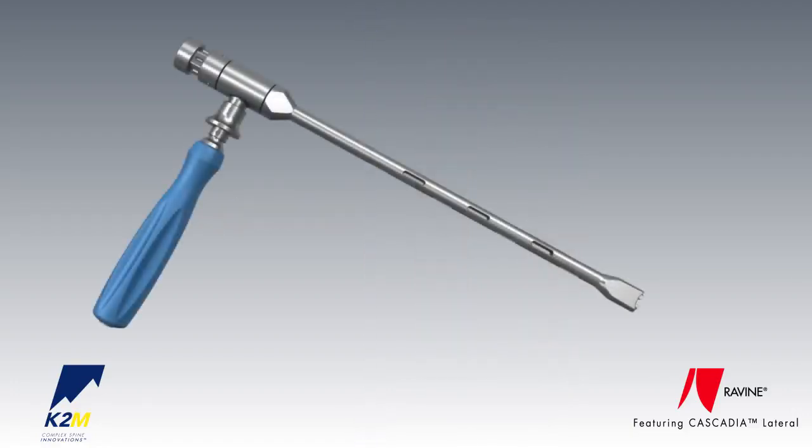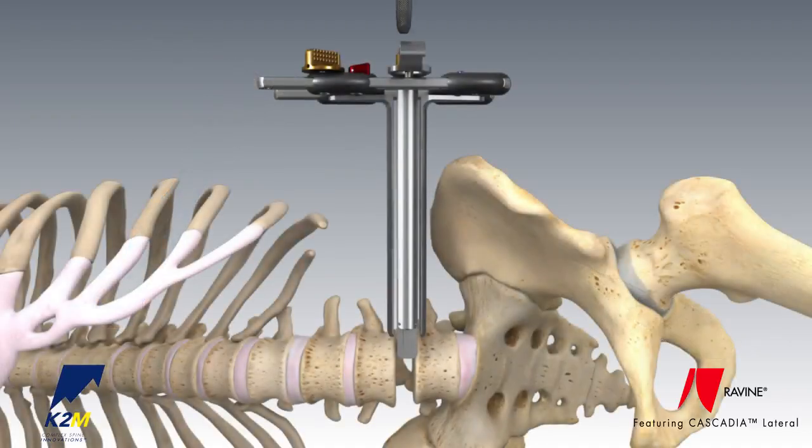For implant insertion, assemble the inner shaft and inserter handle, and then thread the appropriately sized implant onto the end. Graft containment slides are provided to help contain the graft material held by the implant, as well as to protect the end plates if so desired. The bulleted tip of the Cascadia Lateral implant should extend past the contralateral side, just 3 mm beyond the edge of the end plates. This ensures that the implant has maximum contact with the end plates.